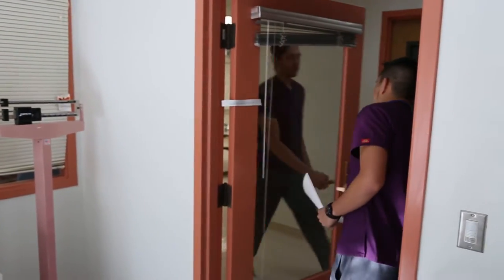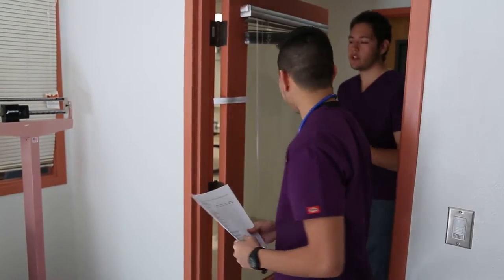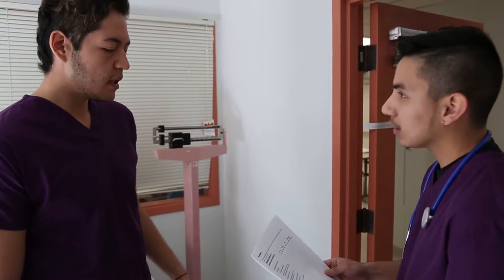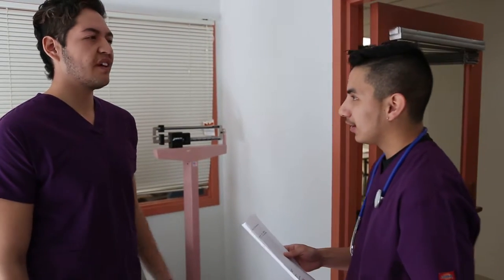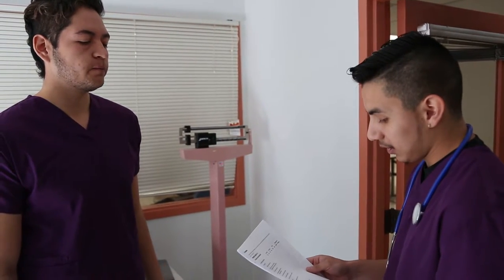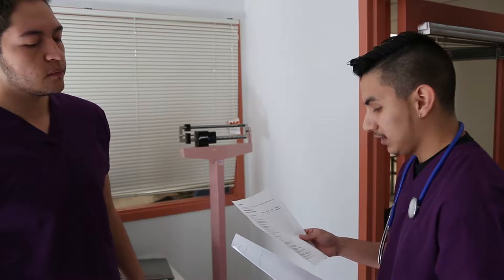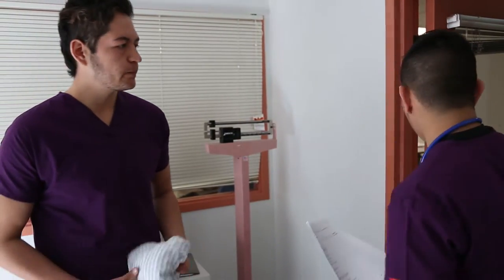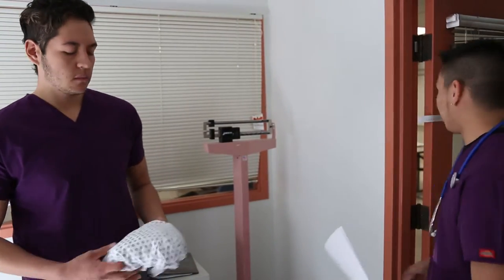Mr. Marcus? How's it going, sir? Before we begin, I'd like to identify you. Could I please get your date of birth? It's 5-2-1-9-4-19. And your first name? Ricardo. My name is Edgar, I'm the ECG tech. The doctor ordered a 12-lead ECG for you — we'd like to do that if that's okay with you. That's fine. Okay, I'm going to need you to put on this gown so we can work on your chest. I'll provide you some privacy and I'll be right back.